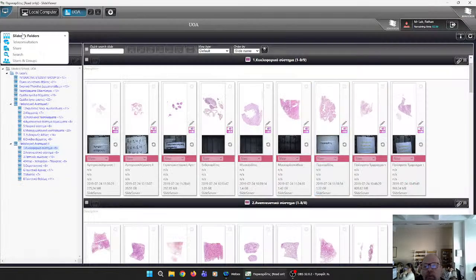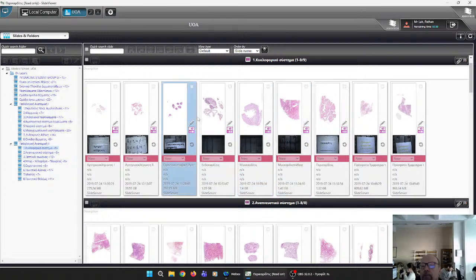Yes, so that's all from the pathology of the circulatory system. We won't have the pathology of the respiratory system because I have uploaded the relevant archive in the 12th playlist. You'll find respiratory pathology microscopic study of virtual slides.